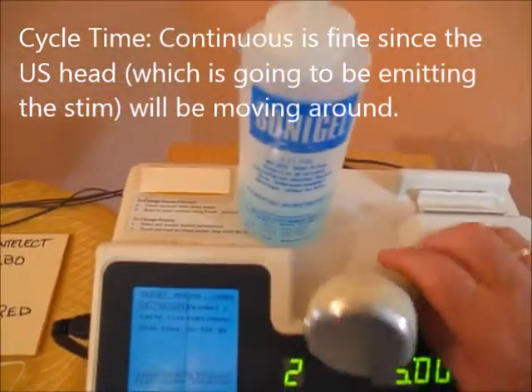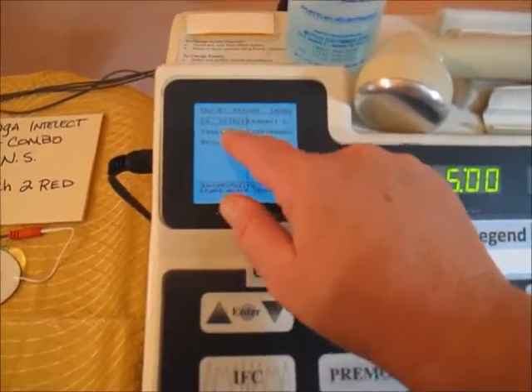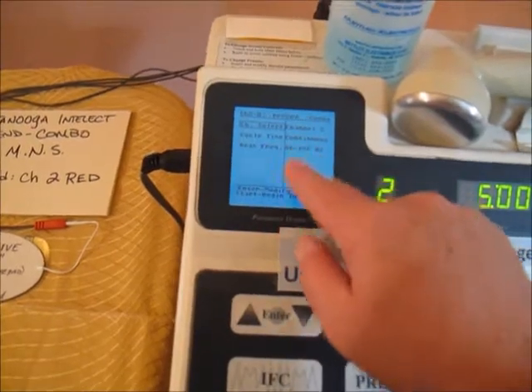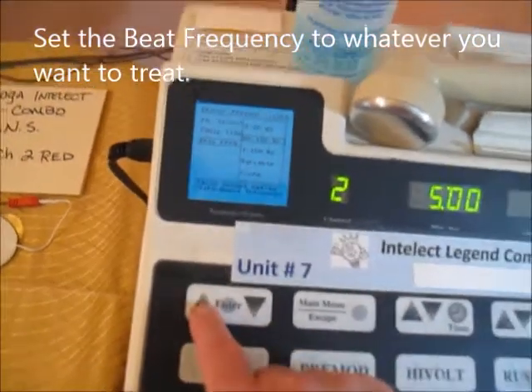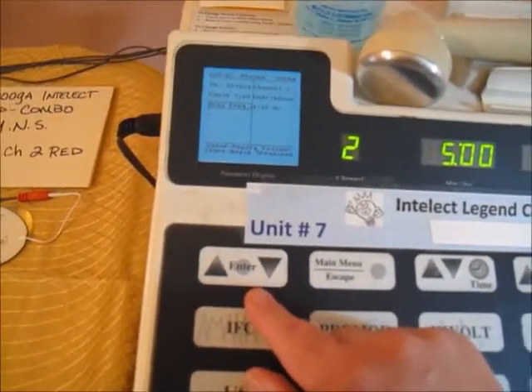You'll use gel, and you don't need to set a cycle time. Cycle time is the on/off phase. Beat frequency is what you'll need to set — for chronic myofascial adhesions, set it to 1 to 10 cycles per second.